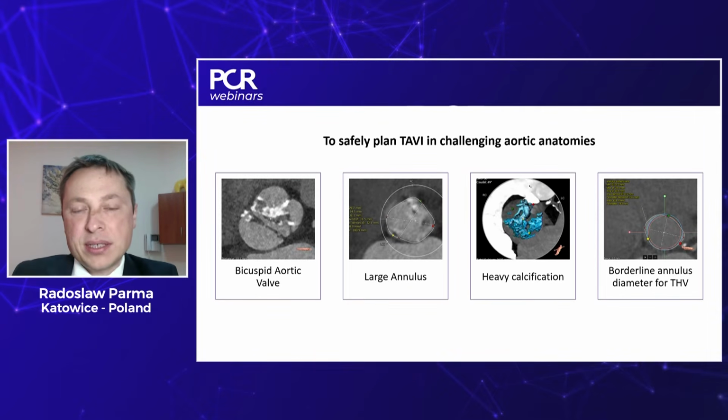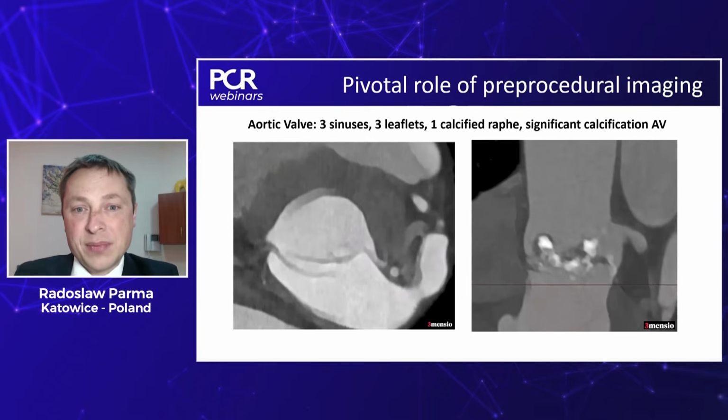What I will discuss, and I would also like you to participate in the chat and ask us questions, will be 4 topics. The first one will be bicuspid aortic valves, which are quite common here in Poland, up to 20% of TAVI screened patients, while in China it is much more, and this is why we can learn from the Chinese professors, operators, about this topic. Also how to tackle large annuli, heavy calcification, and also what to do in cases when the annulus size is in between different TAVI device sizes.